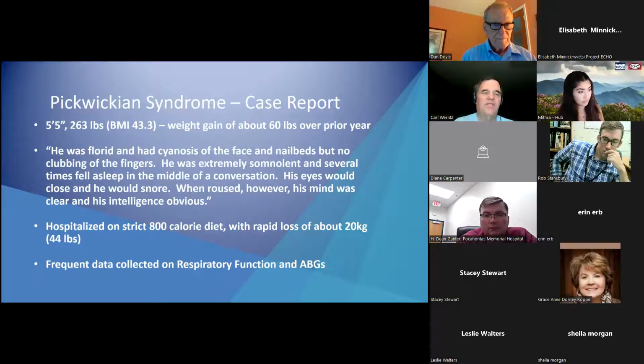For reasons known only to them, but not a bad idea for the purpose of descriptive science, they collected lots of data on respiratory function. Maybe they just got a spirometer and needed to figure out what to do with it.